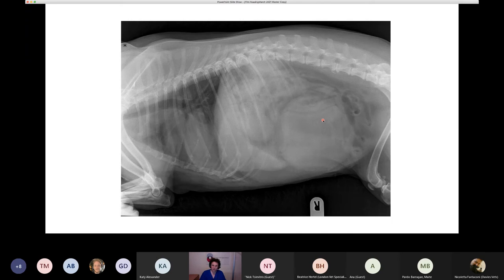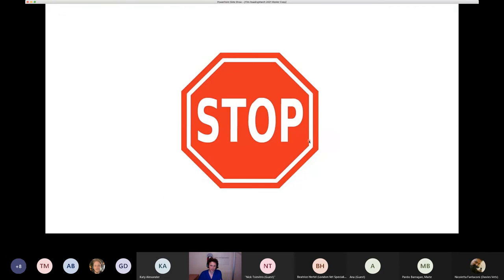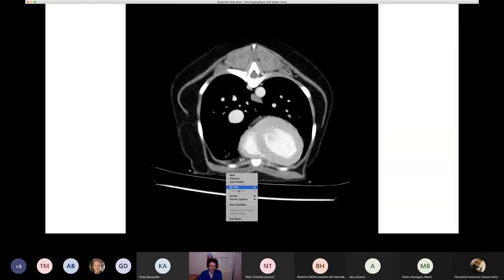We might see a gravel sign, we might see focal dilated loops of bowel. We're not really seeing any of that. We're just seeing bowel that's being displaced. And it doesn't really look like this thing is coming from the abdominal wall or anything else. I mean, it could just be a peritoneal mass, I suppose, just something that's within the peritoneum, but that would be kind of weird. So fortunately, we have a CT scan, which we can take a look at.